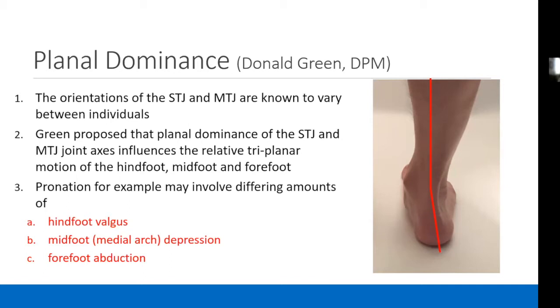But these things, you can have a pronated foot without having calcaneal valgus. It just depends on the dominance, the planal dominance from a podiatric perspective of the joints of the foot and ankle. And so depending on whether or not you have a component of pronation, for instance, in a pronated foot that has very little calcaneal valgus, of course, something to control the hindfoot in the AFO would probably not be too effective. That gets at the gist of what we're talking about here with regard to this algorithm.